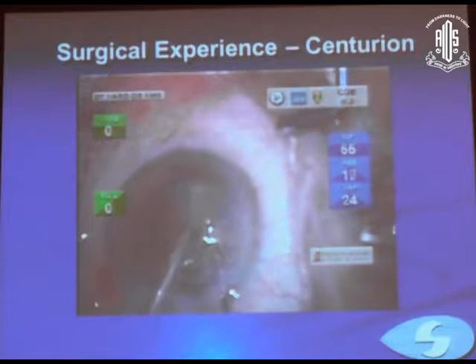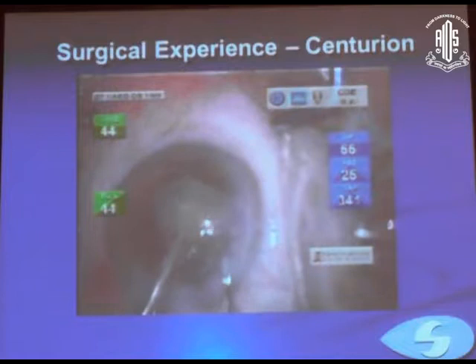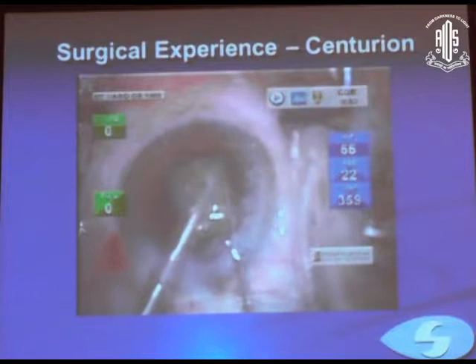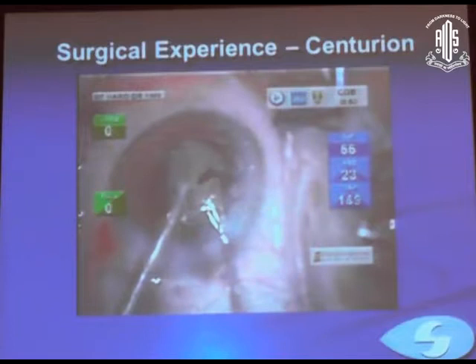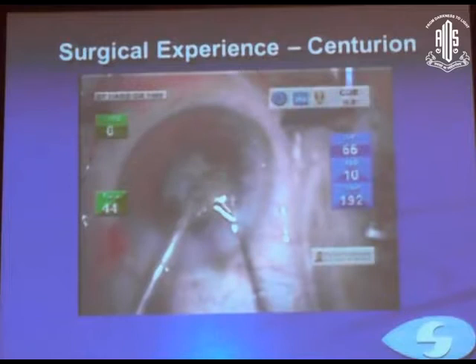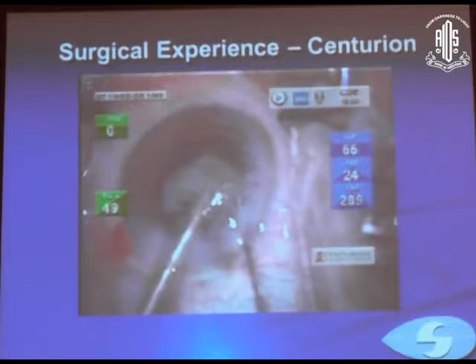This is a small surgical clip to show you that when you hold in position 2, the vacuum you see is building up, 324, 350. As soon as this occlusion breaks and it becomes bare, the vacuum is going to drop. So you see it goes to 144, 145, 146. Actually the vacuum starts falling. In position 3, no other machine will the vacuum fall. You have to prevent surge by other methods, but in this, the vacuum itself falls when you enter position 3, because the vacuum is divided into two components.